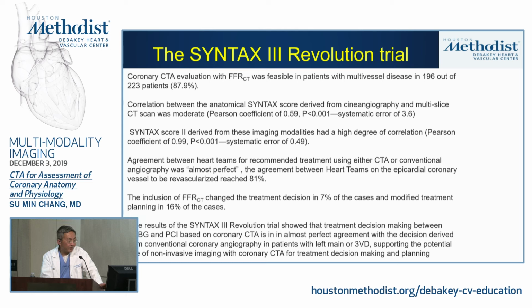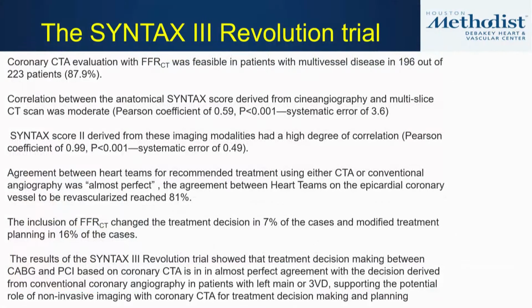This is one interesting thing that I'm going to throw in there in terms of using CTA as a management of patient with severe coronary disease. This is how the Europeans are pushing this. This is done, I think, in Netherlands by Dr. Serruys. You know, he's a guru of PCI. He did the SYNTAX study.